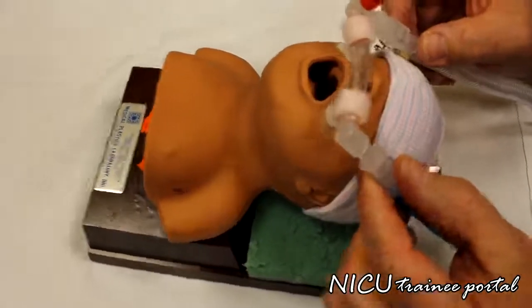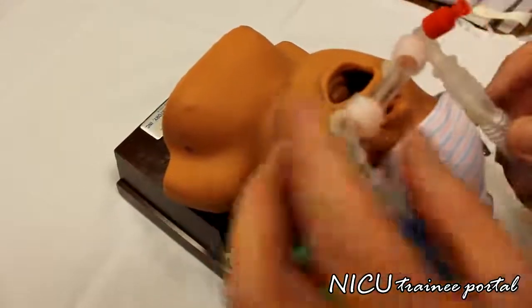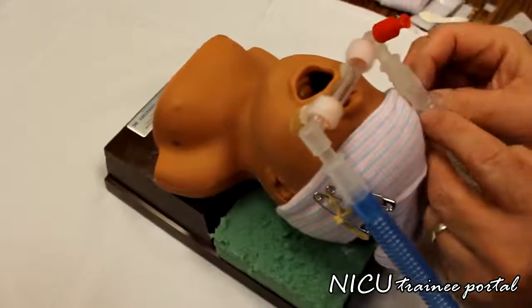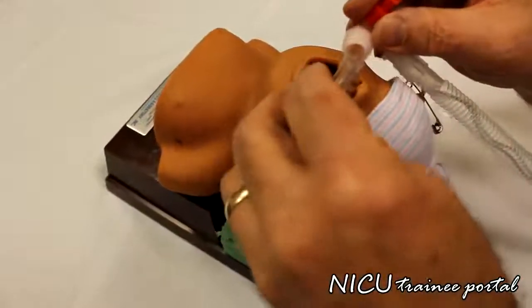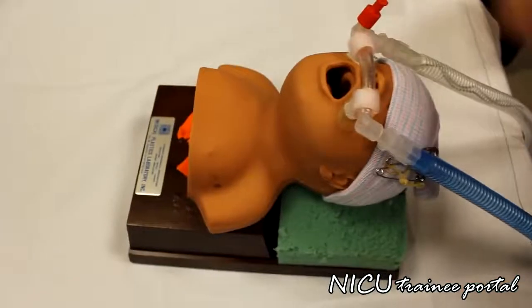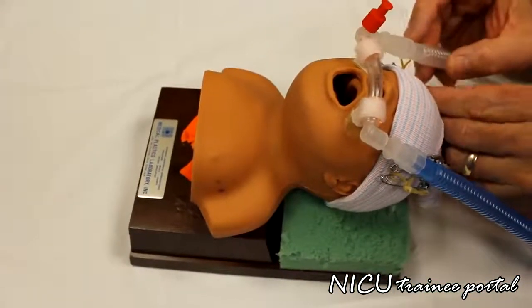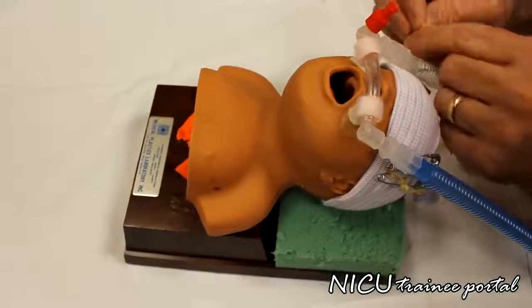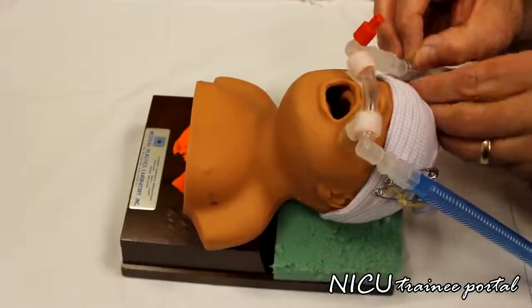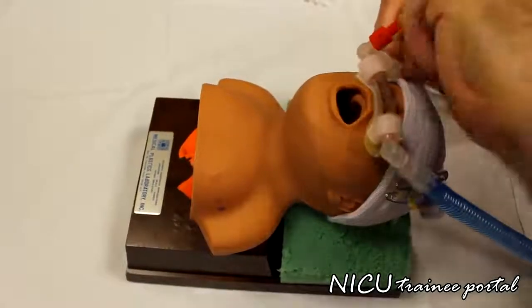Again, we talked about being too tight, you'd see blanching around the ears, and it's definitely too small. The two pieces of Velcro, being the matching part, should hold the prongs down on the upper lip. And then we just take the other end of the rubber band, and we flip it over.